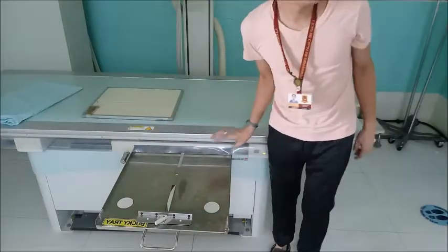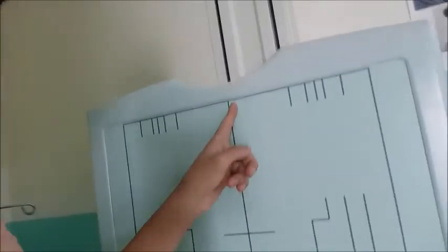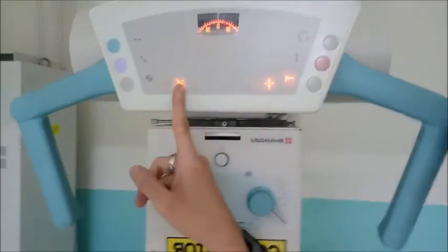So question, how do we adjust the size of the cassette? The center of the cassette, we do not have markings for that. It is not on the table, right? There are no lines on our x-ray table. Okay? So that's the purpose of this light.